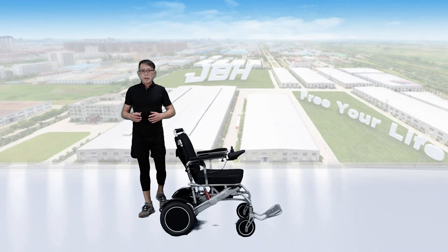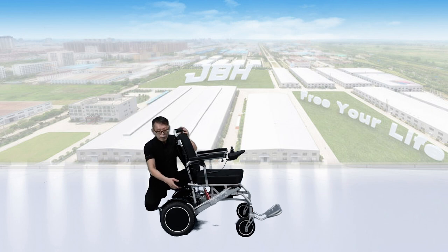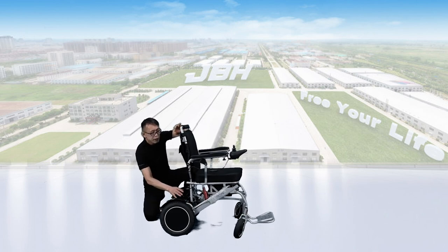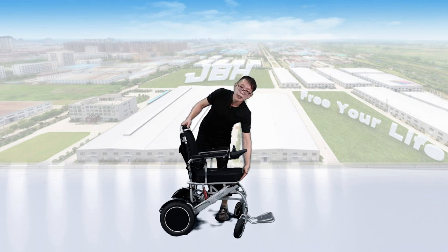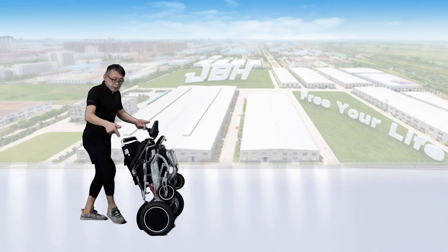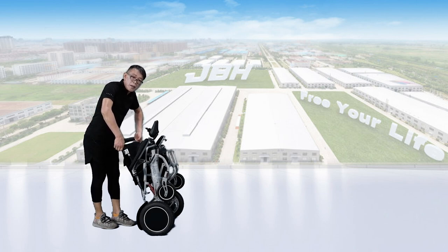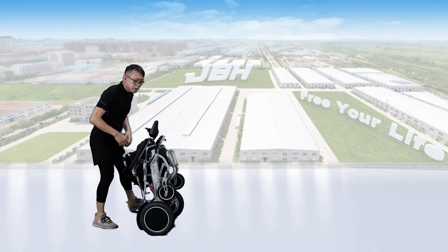To fold up the wheelchair, find the knob on the back and simply pull it out. At the same time, push the seat back forward a little bit. Hold the front of the seat base with one hand and the top of the seat back with the other, then push them toward the center — you can fold the wheelchair in just a few seconds. Finally, the seat back is also foldable: push the two levers on each side and turn the seat back down. The wheelchair is now fully folded.